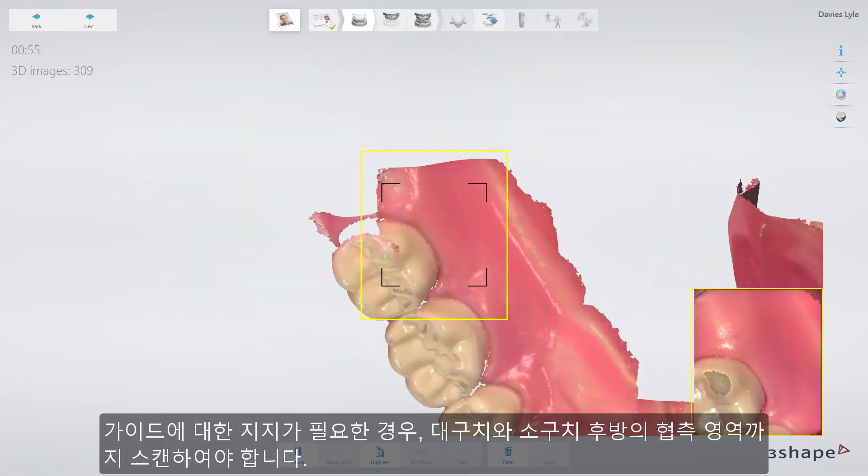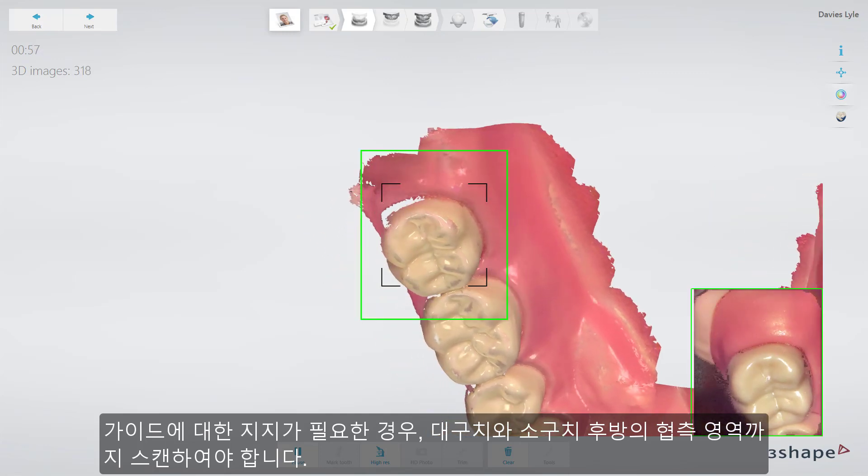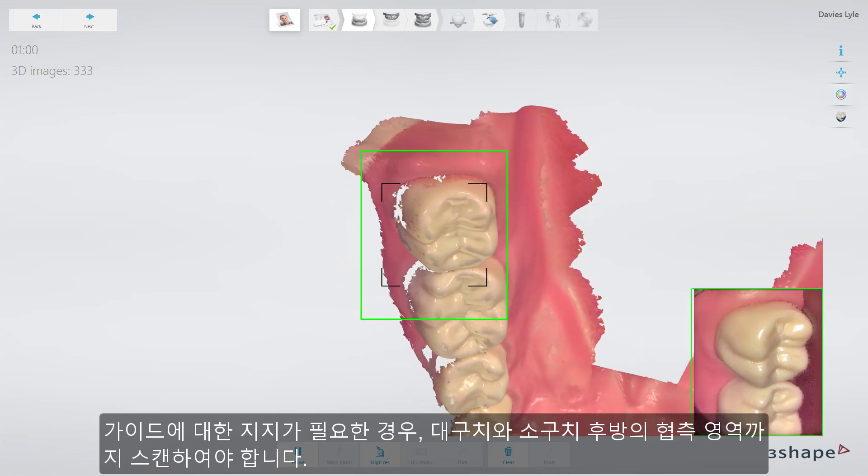Turn to the buccal side, covering the area behind the molar — the retromolar area — in case we need the support for the guide.